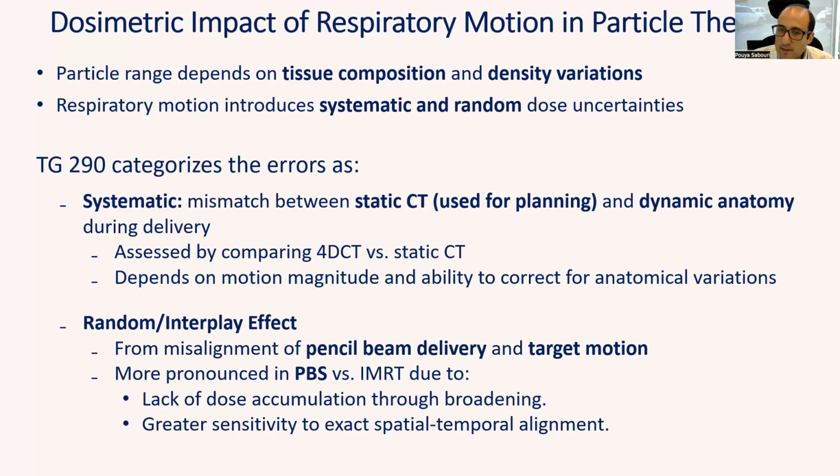And so together, these uncertainties highlight the importance of individualized motion assessment, robust plan evaluation, and the potential motion mitigation strategies such as rescanning, gating, breath hold, and so on that we'll talk about.